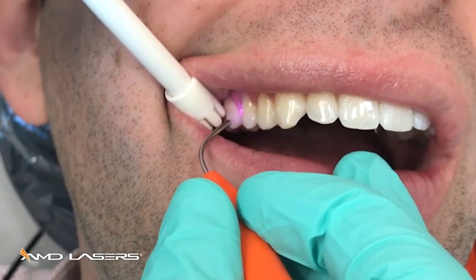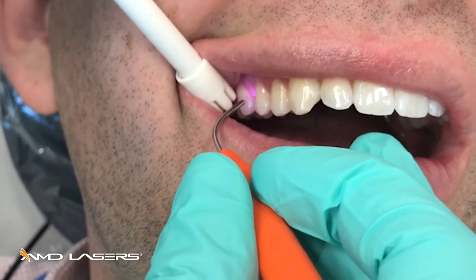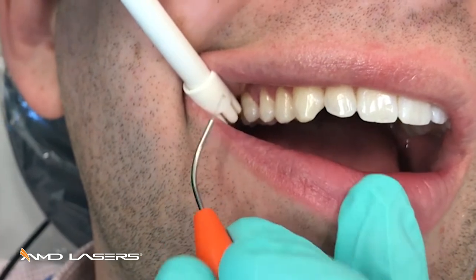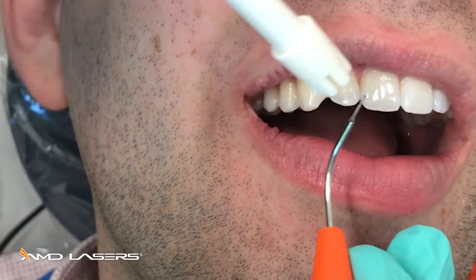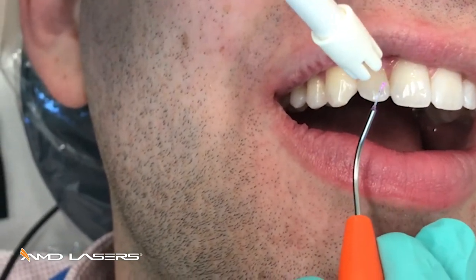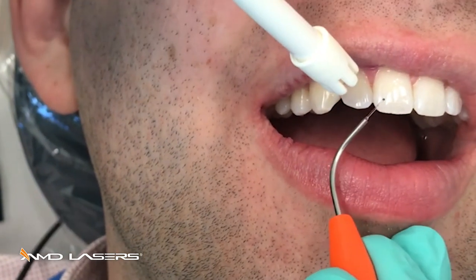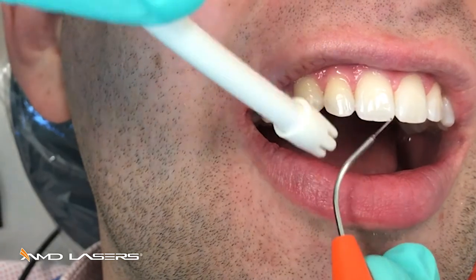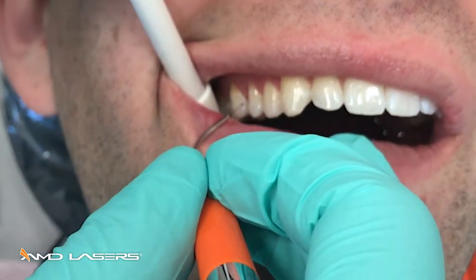I'm gently rubbing against the pocket wall. As I pull out, the diseased tissue is not coagulating on that tip — it's not working — but it is starting to coagulate on there slightly, so I'm at a good working level.